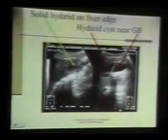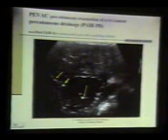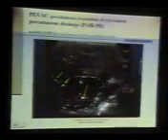This is a solid-looking hydatid on the liver edge. This hydatid cyst was very near to the gallbladder, and sometimes if there is some leakage of the bile there, then another procedure is performed, that is called PEVAC, or percutaneous evacuation of the cyst contents, or percutaneous drainage PAIR PD, or modified PAIR for echinococcal cyst with cystobiliary fistula.